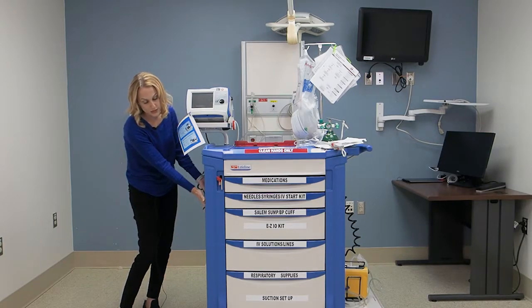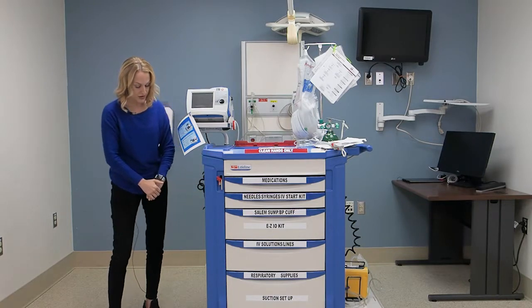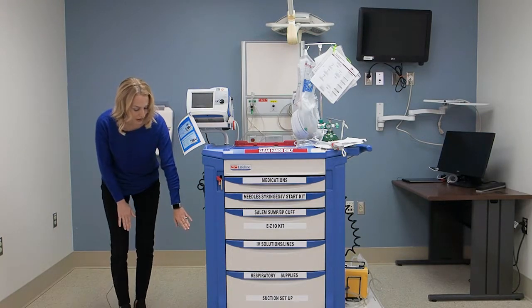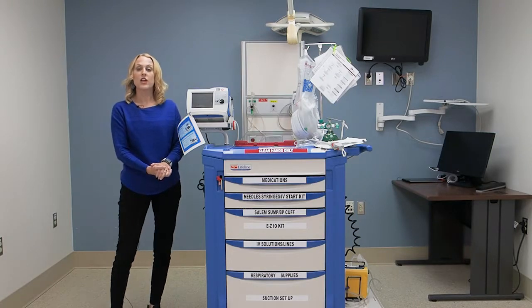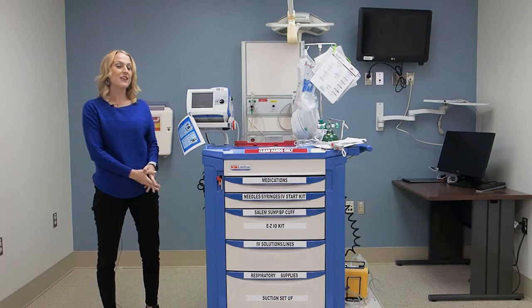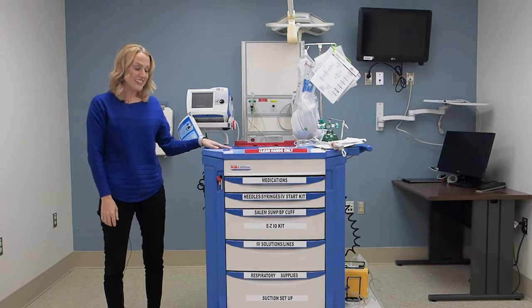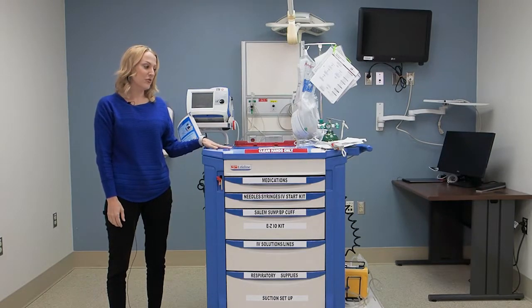So this is a really important side in the event of intubation. That's where you're going to find your supplies. And then on the bottom we have a sharps container. That way, easy access when you're doing a code, you can simply place your sharps into the sharps container located on the cart. So these are the crash carts at our facility.